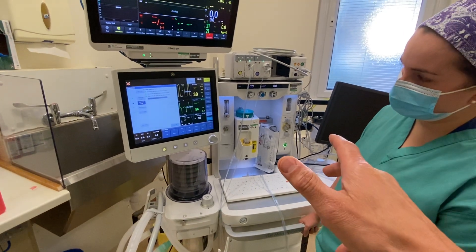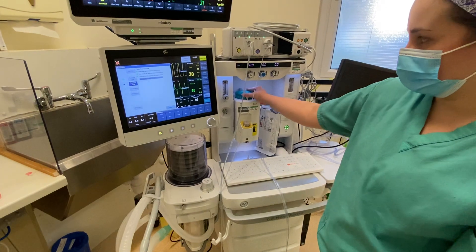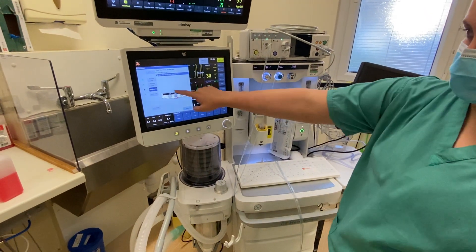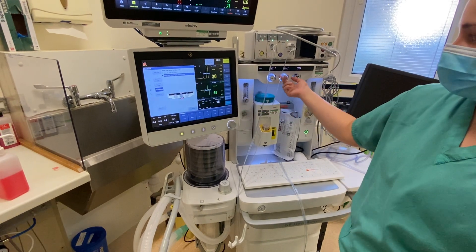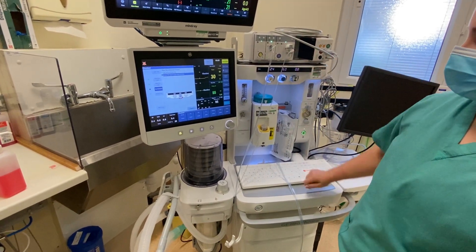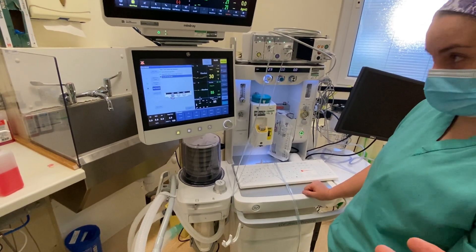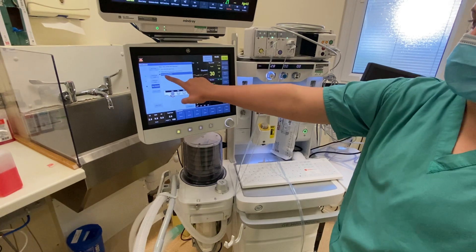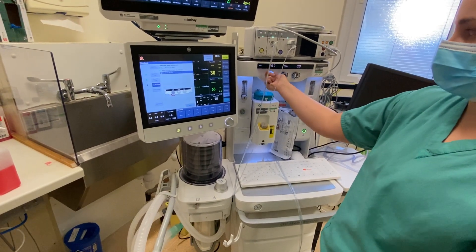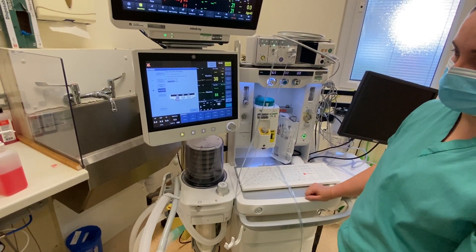You haven't actually switched any gases yet — the only thing I've turned on is the Sevo and turned it off again. I've not tested our hypoxic guard or air delivery at all up until now. So it's just going to ask me to turn on the nitrous above 6 litres. We're testing the Omeda Link 25 system. Then it will say turn off the O2 flow and what we want to see is that the nitrous will turn off at the same time, which it does. The machine will recognise that and make sure that that's all intact as well.